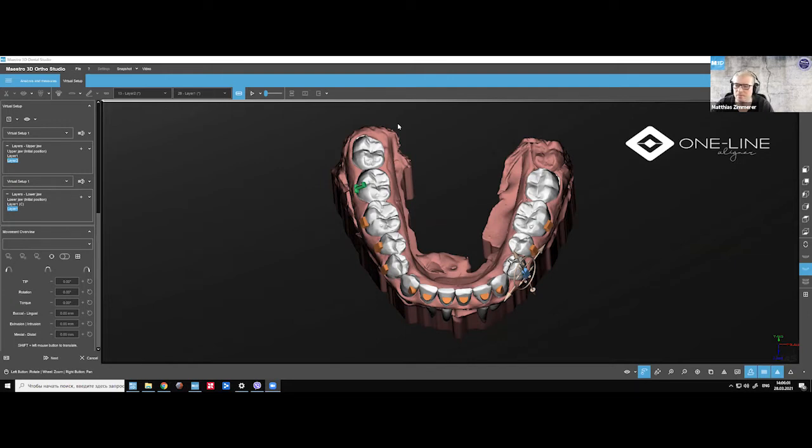Okay. So what is the maximum velocity per layer? What kind of movements can we do per layer? I'm going to post for you the movement which I do per layer. Okay. And then I can explain to you, or do you want me to talk about this right now? Per layer, basically we do movements which have to be in one direction, right? You change a layer because you want to change the direction of the movement. It's very simple. It's not complicated at all. You can go distal and mesial rotation, tipping. You cannot do that together, right? When you do distal, you have to do distal tipping. You cannot do mesial tipping and distal together. It's not going to work. That is what you have to see. That's why you need different layers.